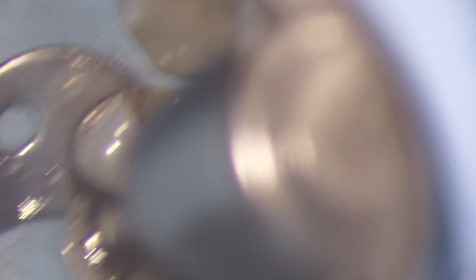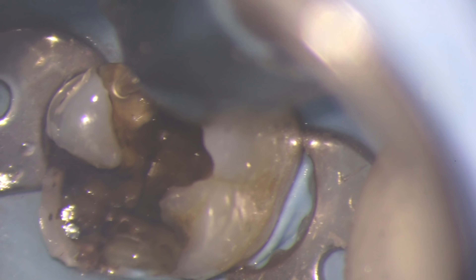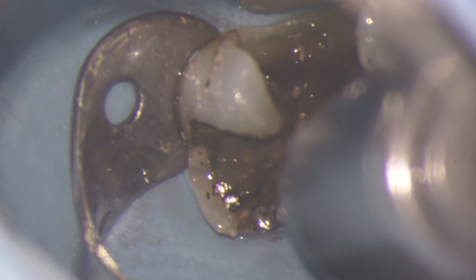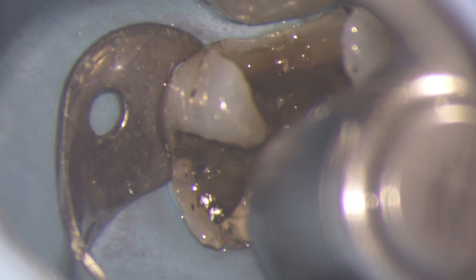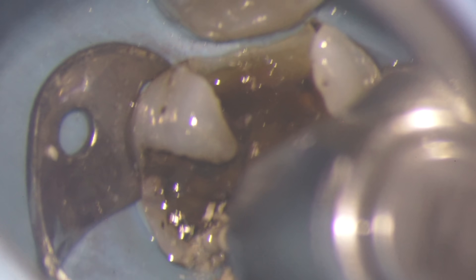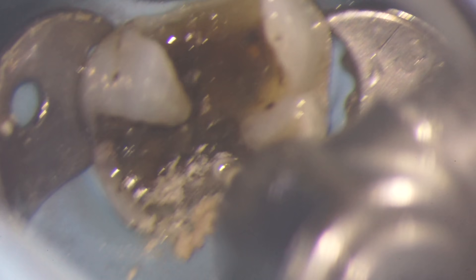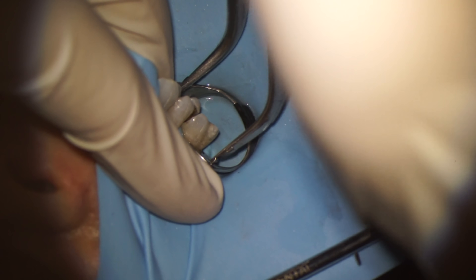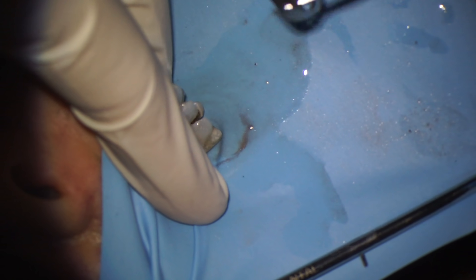Now what's left underneath is a couple of silver pins in the bottom left corner, and also some soft decay. That decay is really important to remove because it's infected with bacteria that can cause problems for the tooth down the road. So I spend some time removing all the decay. Keep in mind that not all of the dark stuff is actually cavity — some of it's healthy tooth structure that's just been discolored because of the silver filling.